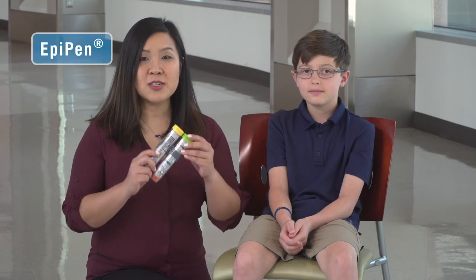I will demonstrate how to use all three forms of epinephrine auto-injectors. First, we will start with the EpiPen.